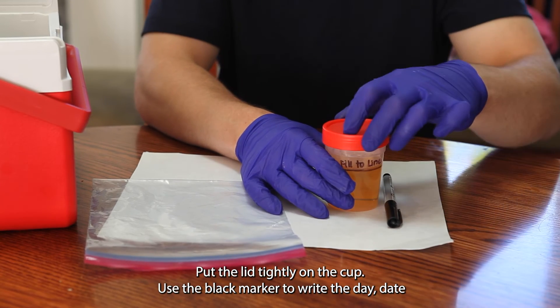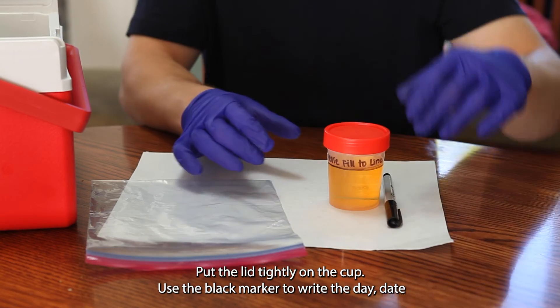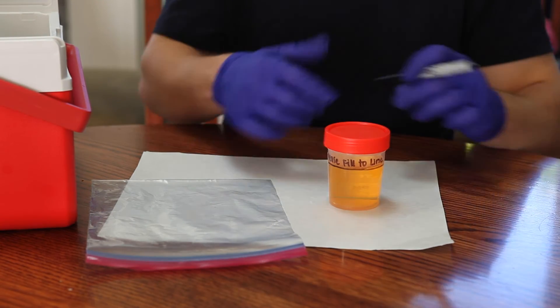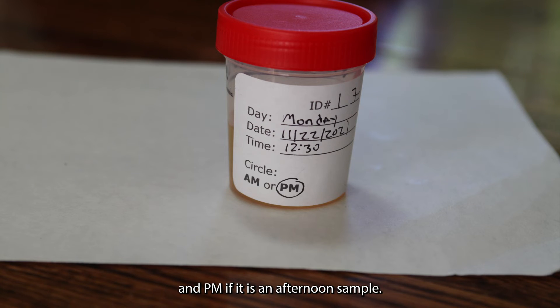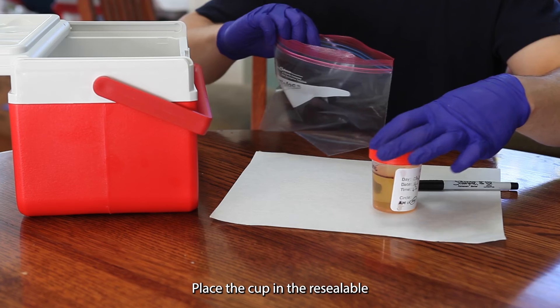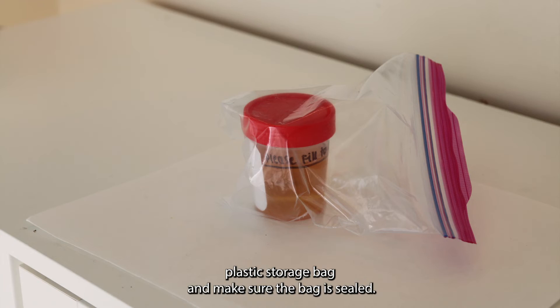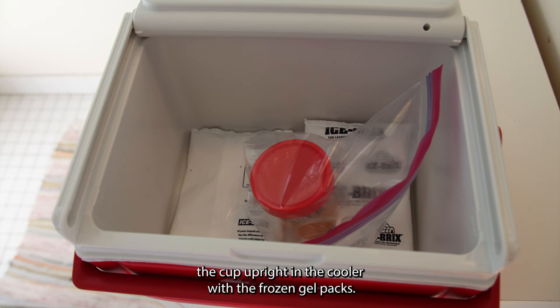Next, put the lid tightly on the cup. Use a black marker to write the day, date, and time on the urine cup. Circle AM if it is a morning sample and PM if it is an afternoon sample. Place the cup in the resealable plastic storage bag and make sure the bag is sealed. After collecting the sample, immediately place the cup upright in the cooler with the frozen gel packs.